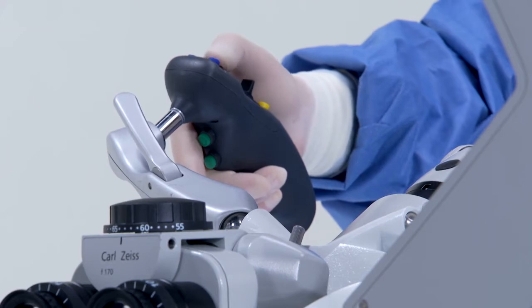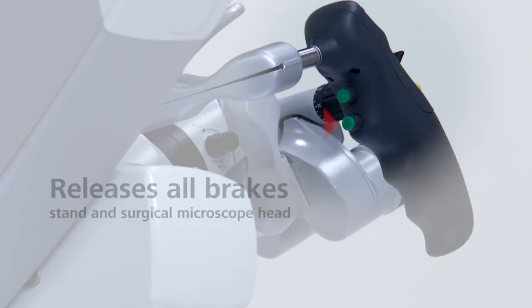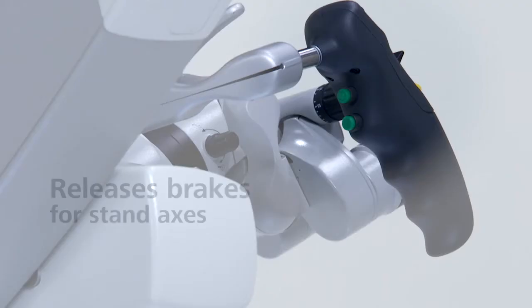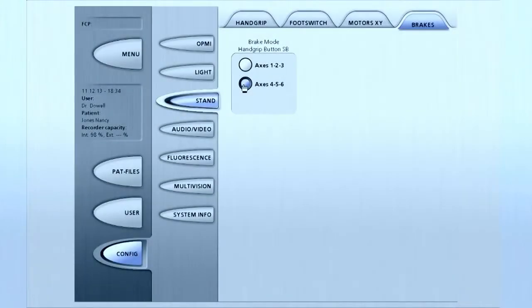The green brake release buttons are located on the back of the hand grip handles. The bottom button is programmed to release the brakes for all stand and microscope axes, allowing the system to move freely in all directions. The factory setting for the top button releases only the brakes for the stand axes — axes 4, 5 and 6. You can configure this button in the stand touch screen menu under the brakes tab.